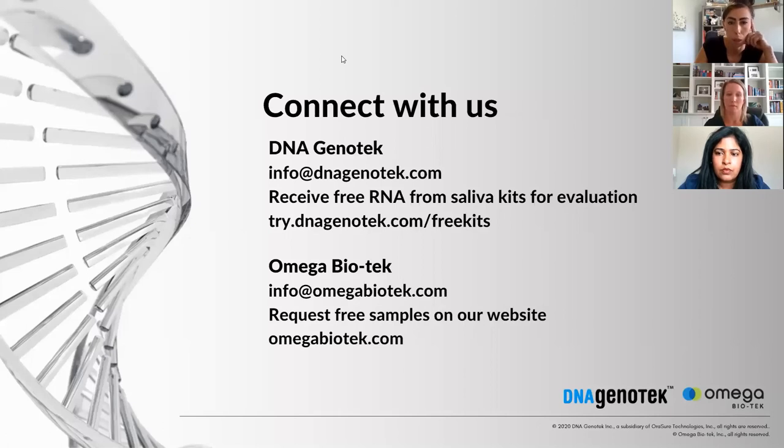Okay. And then is 56 degrees C enough for inactivation? Yeah, so we actually have recommended increasing this to 56 degrees. Our devices are robust enough to withstand that increased temperature, and it just allows for inactivation of the virus. Okay.